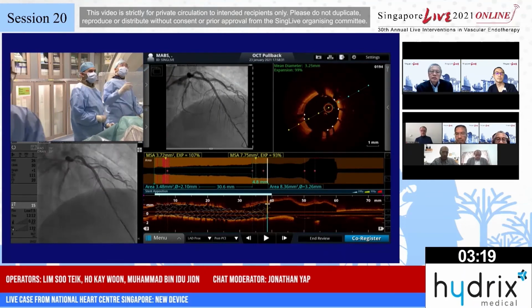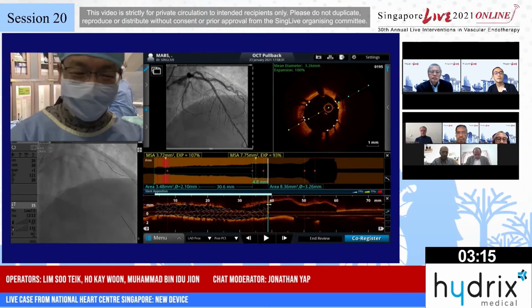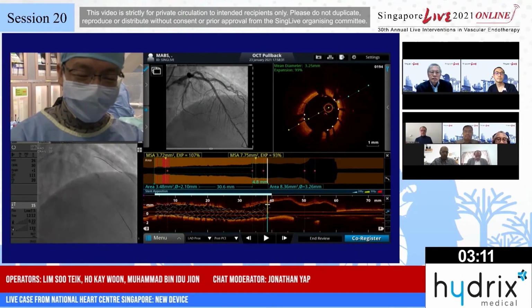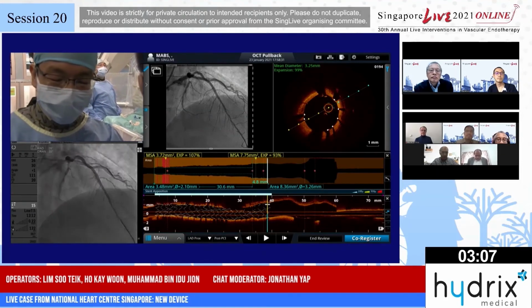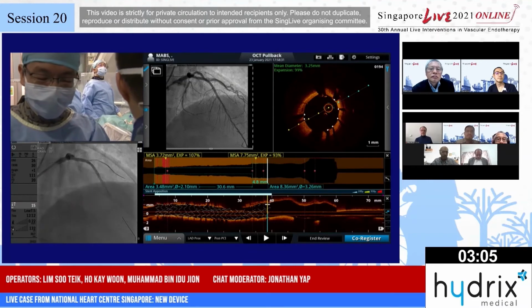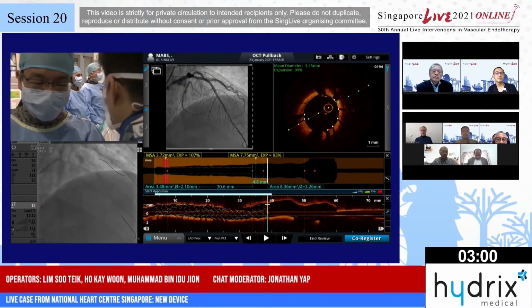That means you have the fly through and see. Expansion index should hit at least 80 to 90% for optimal expansion. So in this case, I think both the distal expansion and the proximal expansion hit the criteria of at least exceeding 80%. In fact, actually exceeded 90%. So it looks well expanded at both the distal and the proximal edge.